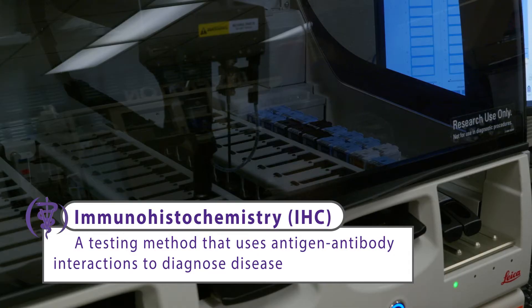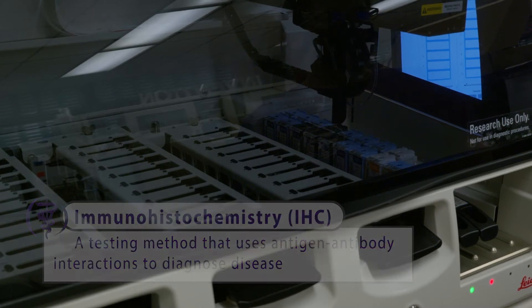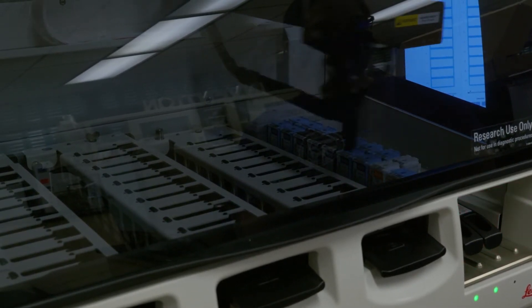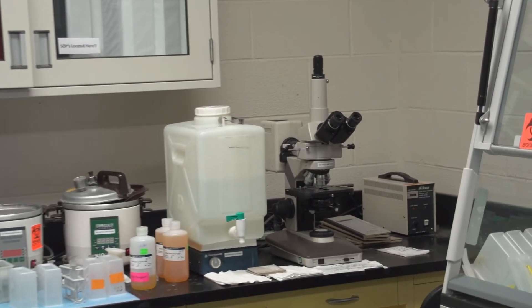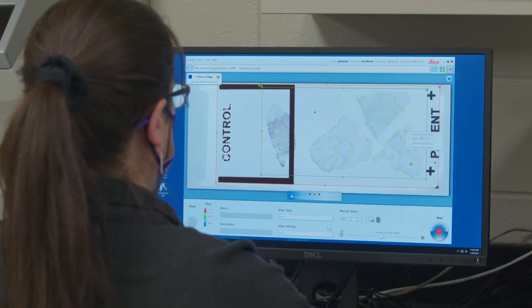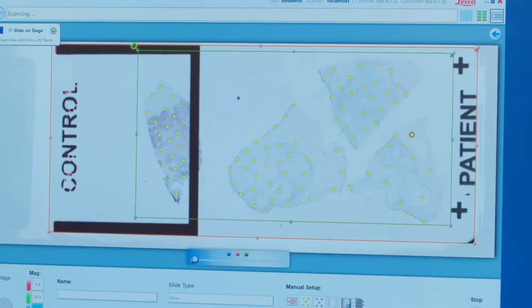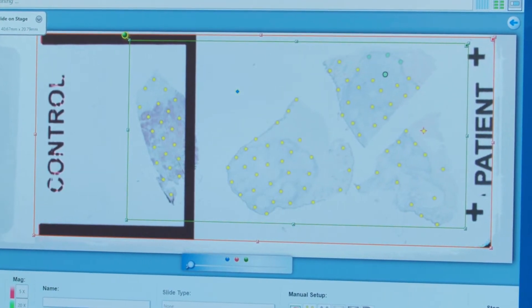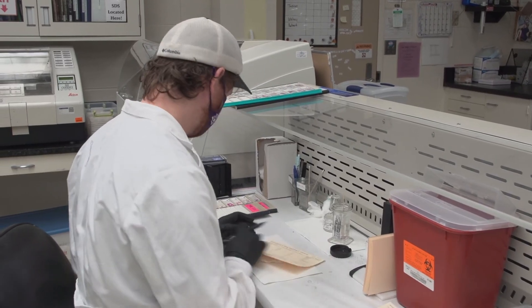Immunohistochemistry, or IHC, is another critically important tool used by our pathologists in the diagnostic process. IHC allows us to use unique and specific antigen-antibody interactions to demonstrate specific antigens within tissues, which we detect under a microscope using a chromogenic reaction or a color change. This allows us to diagnose infectious diseases by identifying bacteria or viral antigens within diseased tissues, or to more fully characterize cancer cells or neoplastic diseases, which has significant impact on how those diseases will be treated by clinical veterinarians.